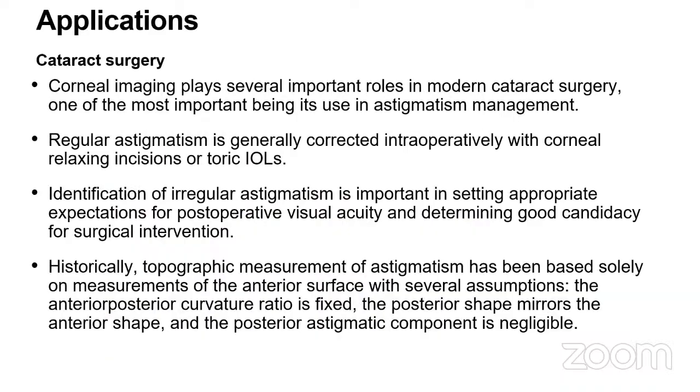Then coming to applications of the Pentacam in cataract surgery, corneal imaging plays several important roles in cataract, one of the most important being its use in astigmatism management. Regular astigmatism is generally corrected intraoperatively with corneal relaxing incisions or toric IOLs. Identification of irregular astigmatism is important in setting appropriate expectations for post-operative visual acuity and determining a good candidacy for surgical intervention.